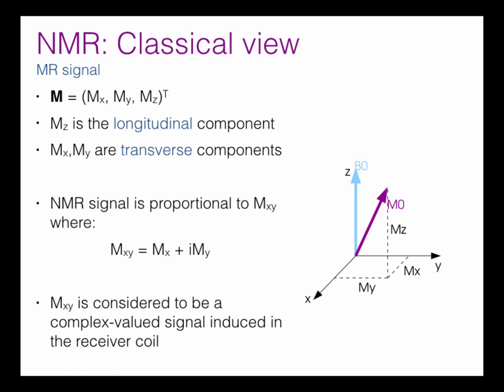But that's kind of in the details. The main thing I really want you to take away from the slide is that the only thing we can detect is the Mxy term, and it's considered to be a complex signal.